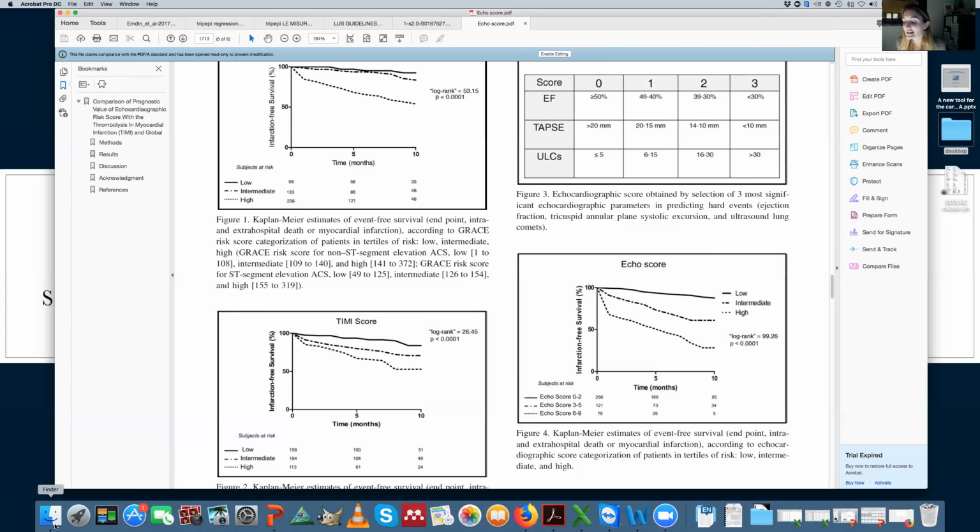It shows how much the system is dynamic. Soon you have the extravascular lung water. This is very typical, and it's a sign of how much the lines are dynamic.